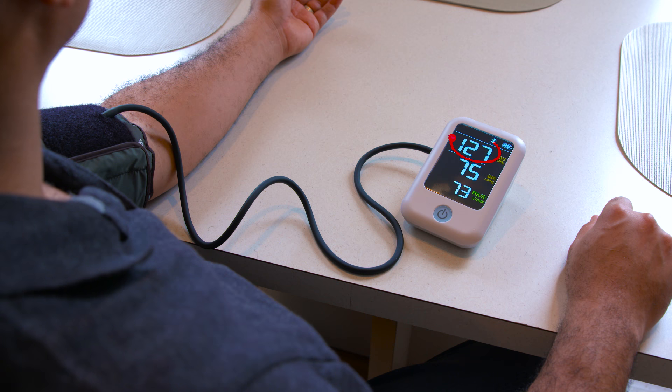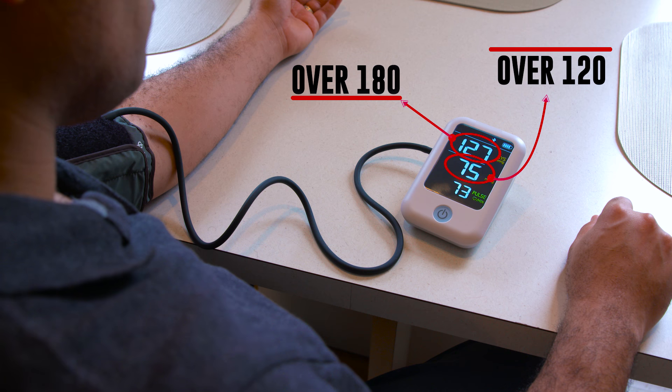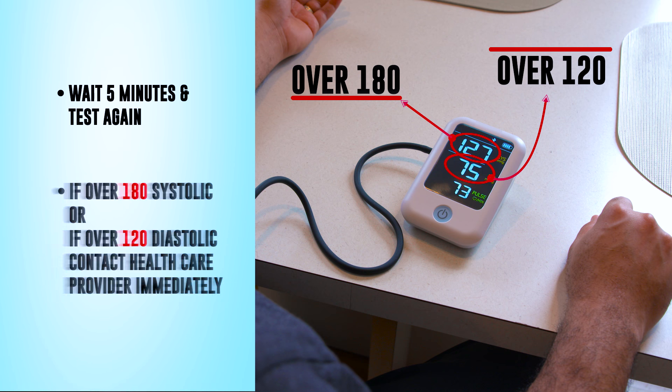If your top number is above 180 or your bottom number is over 120, wait five minutes and test again. If the reading is still above 180 systolic or 120 diastolic, contact your healthcare provider immediately.